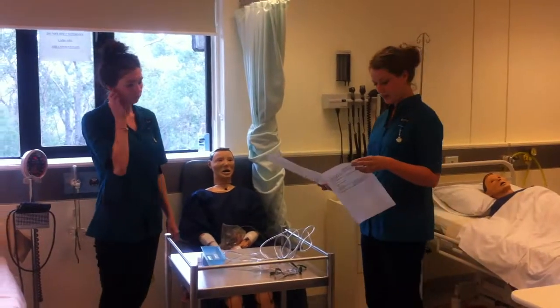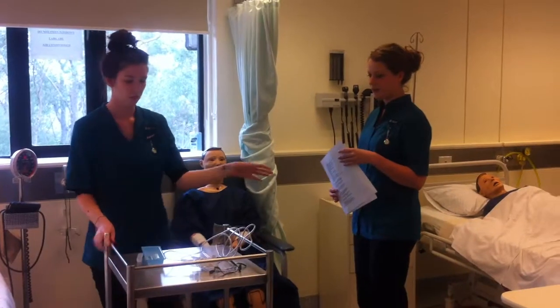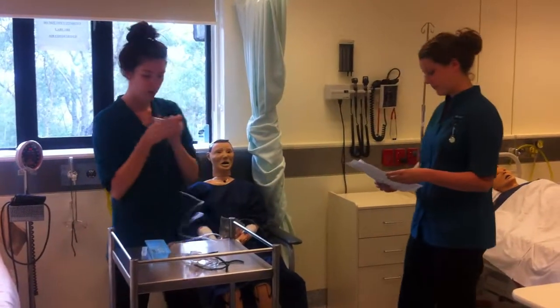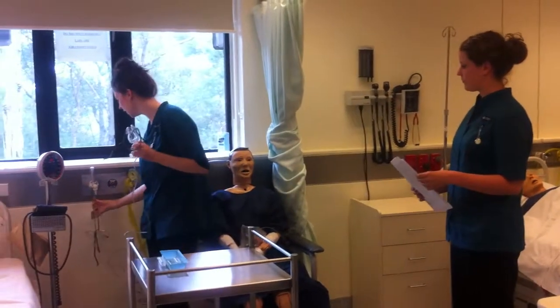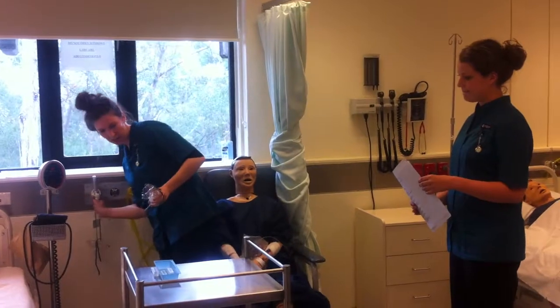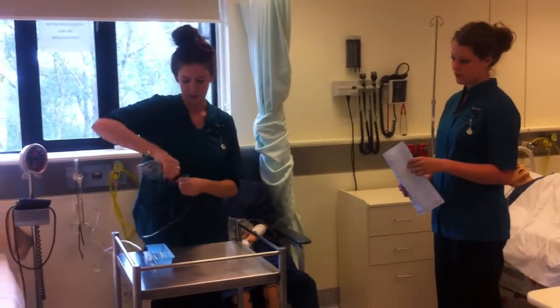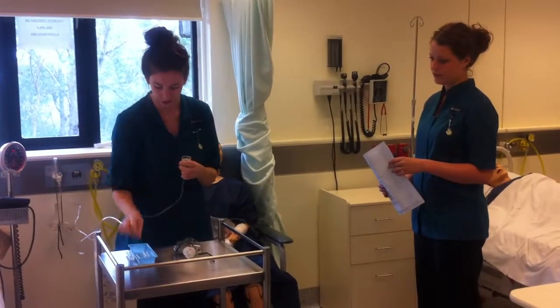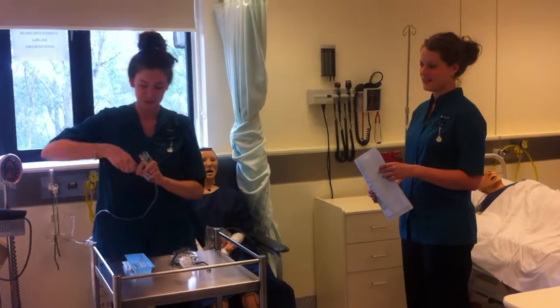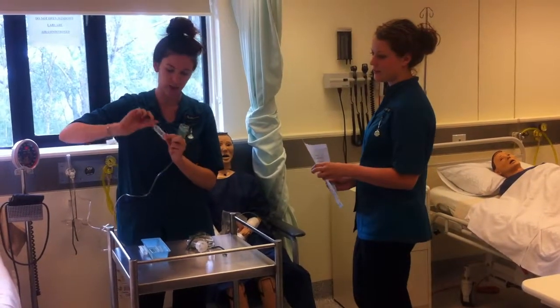Okay, so we've checked the prescription. Now Penny's going to get the nebulizer all organised. With the nebulizer, we just put this back into the oxygen and make sure it's secured tightly. And then with the drug, you just pop this part off like that. And this is the Ventolin. Just check the date and expiry. And it's the right thing.